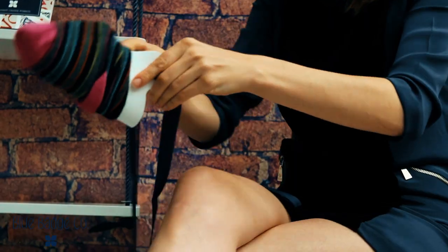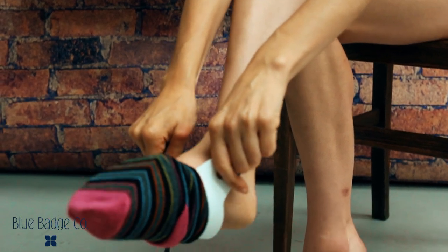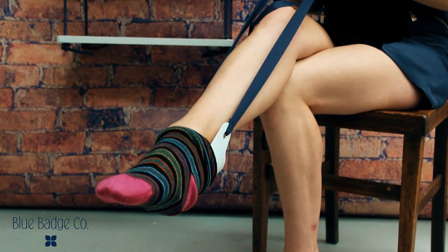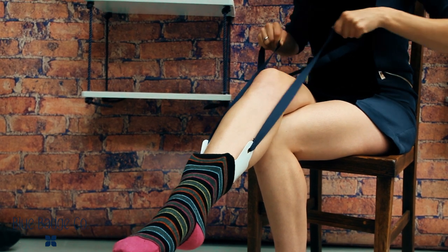Once the sock is in position, you can take hold of the handles of the sock aid and slide your foot slowly and gently into the plastic casing. Make sure that you push your toes right to the end of the sock before you start gently pulling towards you on the handles and the sock should nicely fall into position.